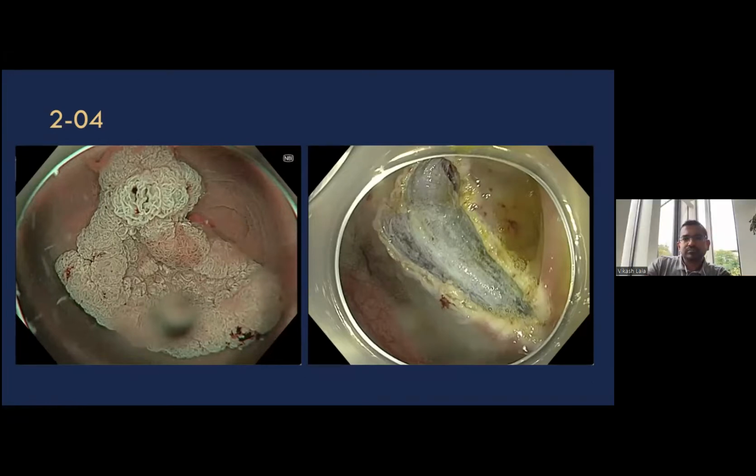Well, I think there's significant evidence that you should use a distance attachment. It doesn't have to be a cap. It could be an endocuff, could be anything to increase your adenoma detection rate. So I think that where funding allows, and that is a serious problem actually, even for us here in Belgium, highest healthcare spend per capita in Europe, it's still a problem to get the patients or the healthcare system to agree to adding a cap. But indeed, we use it routinely for diagnostic colonoscopy. So that's the answer to question number 1.